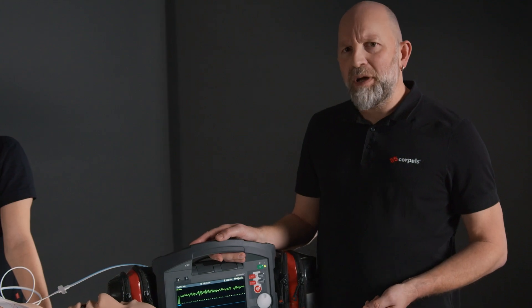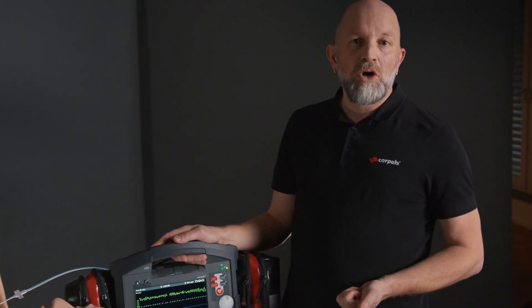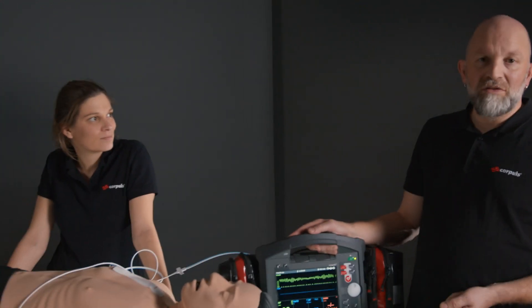The special feature of manual mode is that we have to decide ourselves whether the rhythm is suitable for defibrillation or not, which synchronization method we choose, and what energy we want to apply. We can set these individually.